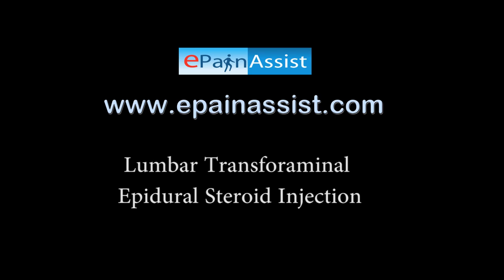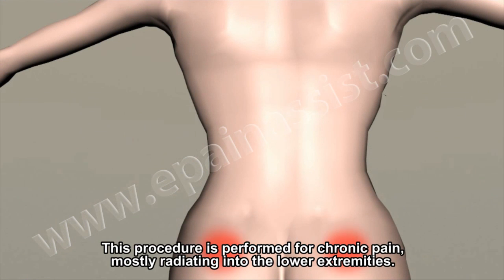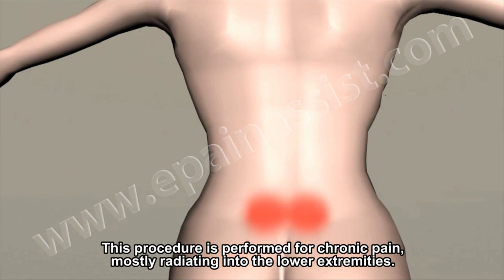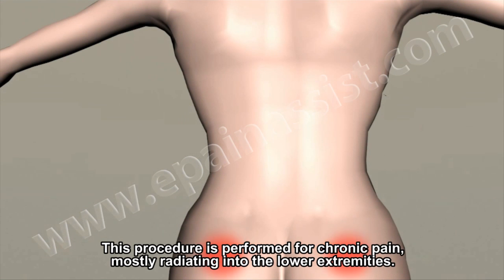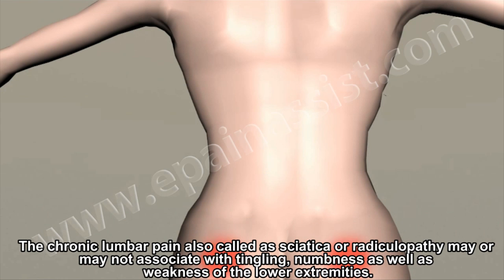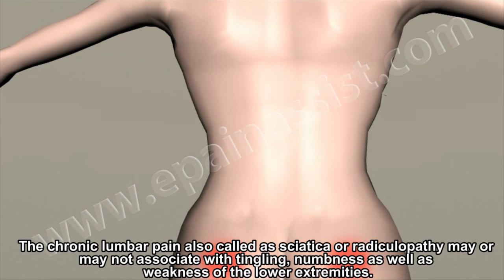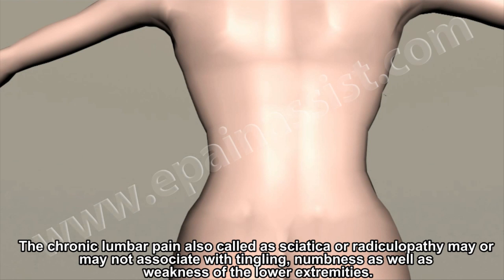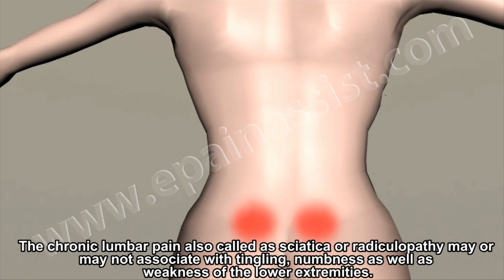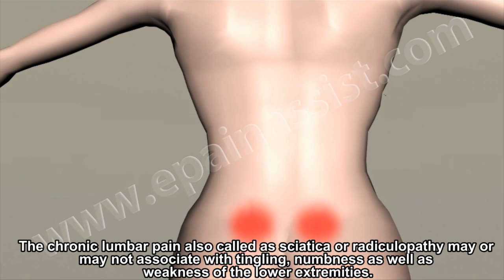Lumbar transforaminal epidural steroid injection. This procedure is performed for chronic pain, mostly radiating into the lower extremities. The chronic lumbar pain, also called sciatica or radiculopathy, may or may not be associated with tingling, numbness, as well as weakness of the lower extremities.